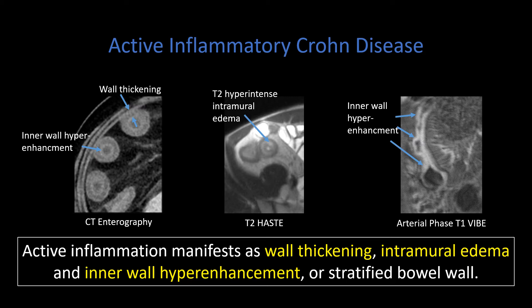These loops of distal ileum show wall thickening with inner wall hyper-enhancement and a nice targetoid or stratified appearance. Looking at a correlate on MRI, we can see again the targetoid appearance of the bowel, and notice that the submucosa in this case is T2 hyper-intense, indicating submucosal edema. On post-contrast MRE imaging, we can also see in this case very severe active inflammation with that robust inner wall hyper-enhancement. In the past this was called mucosal hyper-enhancement, but in severe active inflammation the mucosa is often denuded, so we now refer to it as inner wall hyper-enhancement.